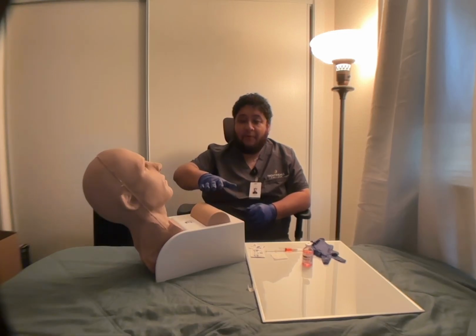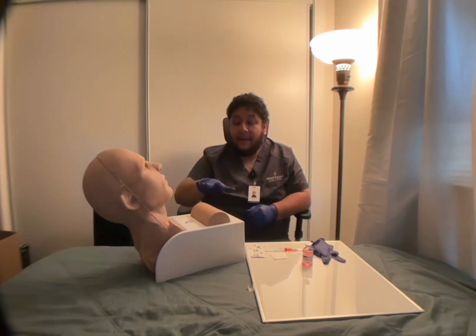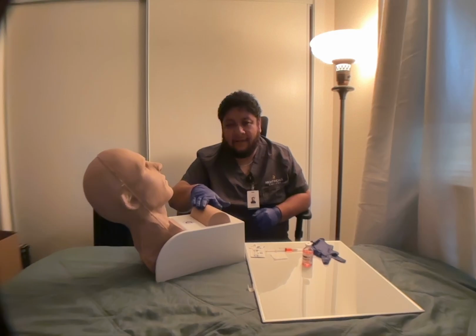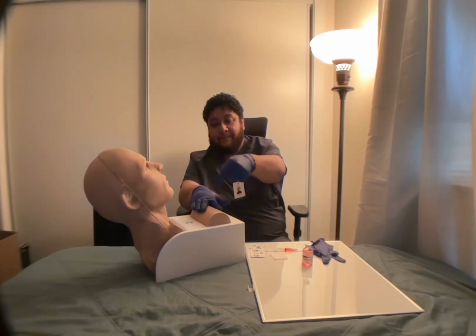Now I'm going to extend my index finger towards the anterior superior iliac spine, and then spread my middle finger back along the iliac crest to form a V, which is here, just for showing purposes. Now let's demonstrate on this piece of the prop. The V will be like so, and the injection will be at the center of this V. Okay?